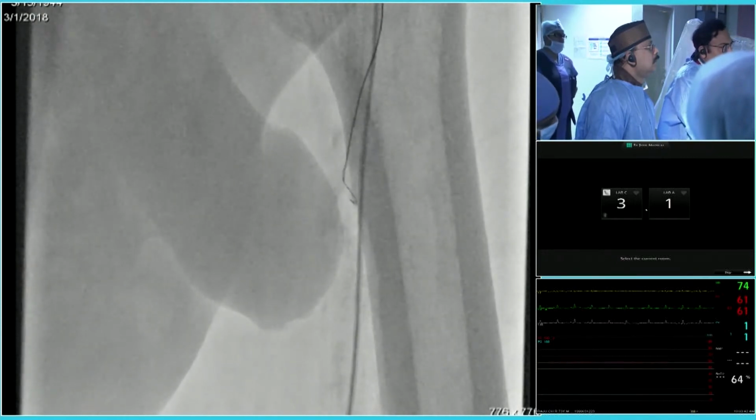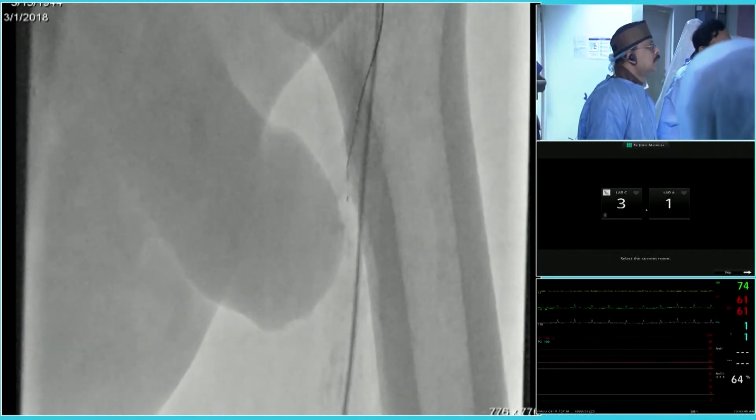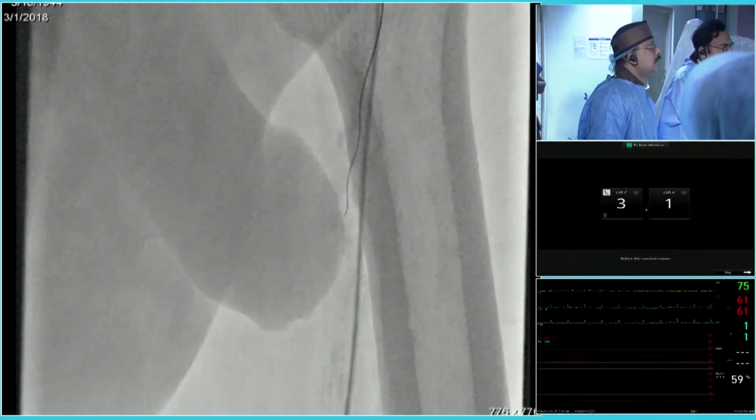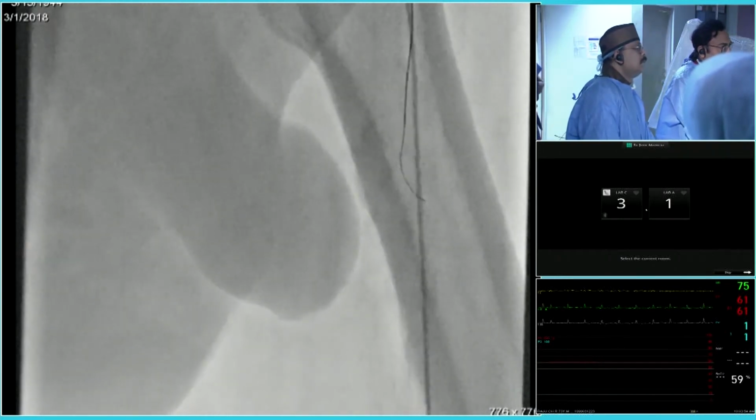So this is the Conquest Pro. Go to the other view.